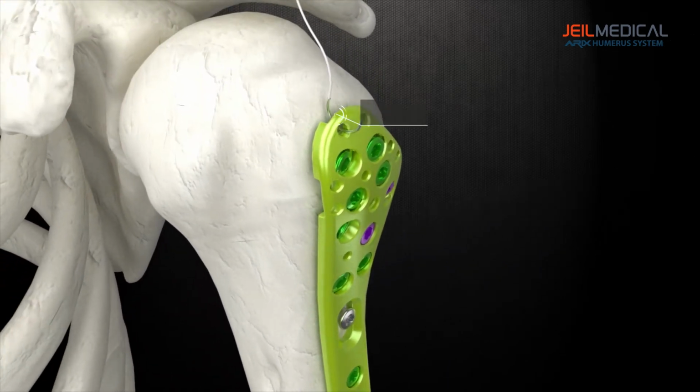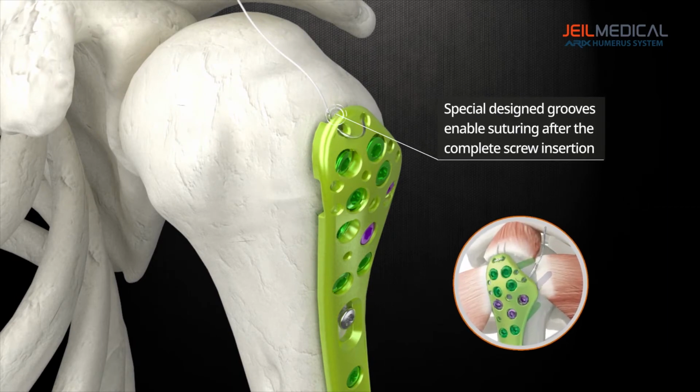Special grooves in three proximal locations of the plate allow suturing after the plate fixation.